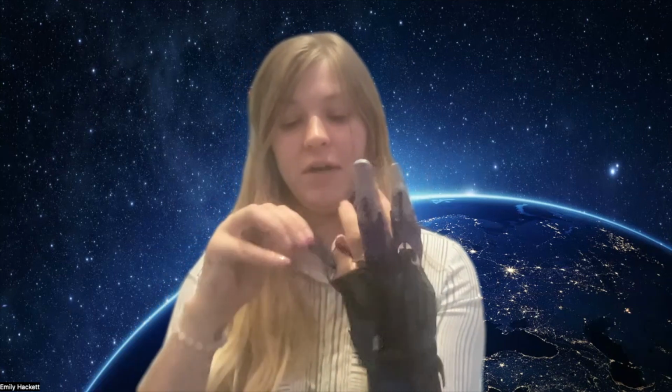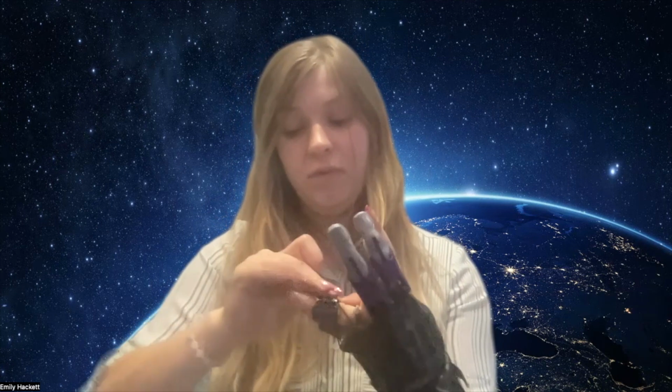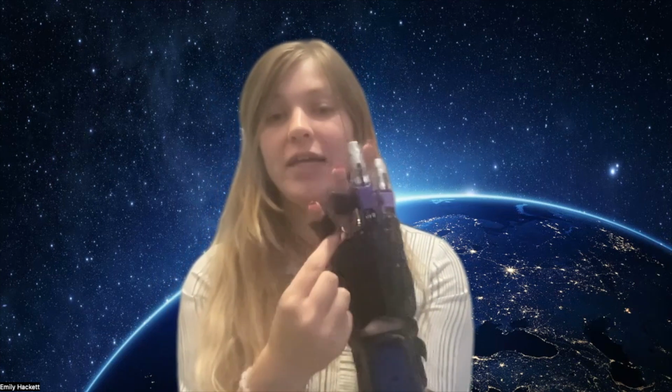So you have foam cushion here to not damage the scar tissue. It causes a soft padding because scar tissue is very fragile. And it velcros around the finger very tightly to form compression, which mimics a massaging technique that physical therapists use to further soften and break down scar tissue. Then the elastic cord back here props the fingers up to create tension in the fingers and cause stretching automatically in the tendons.